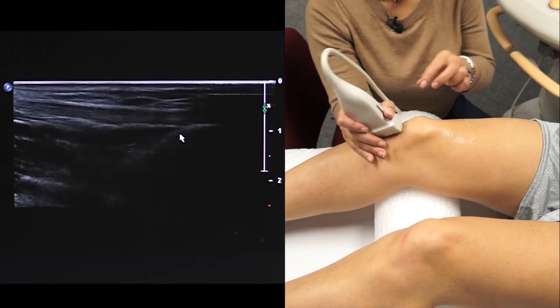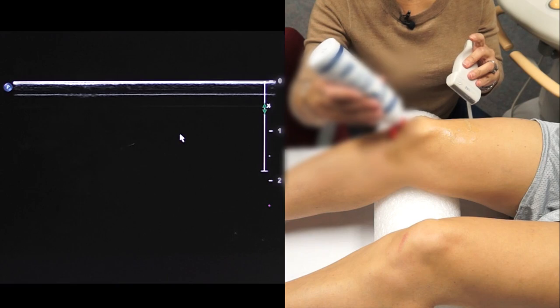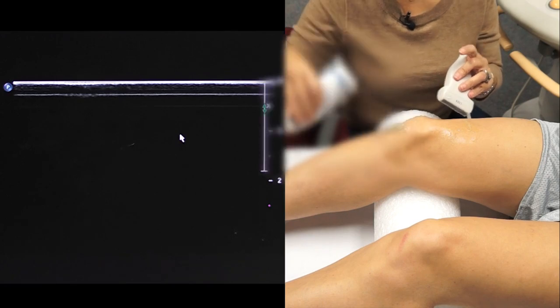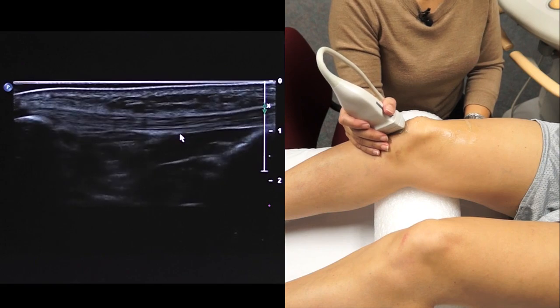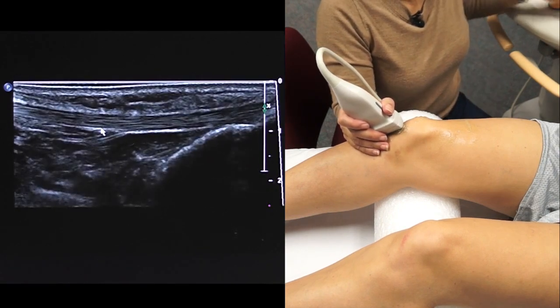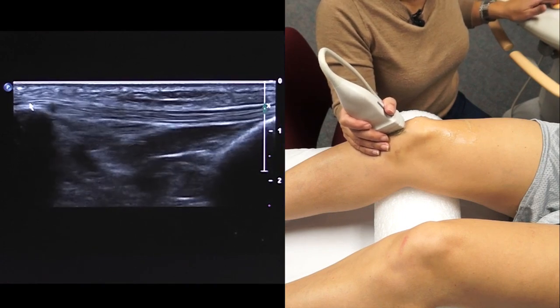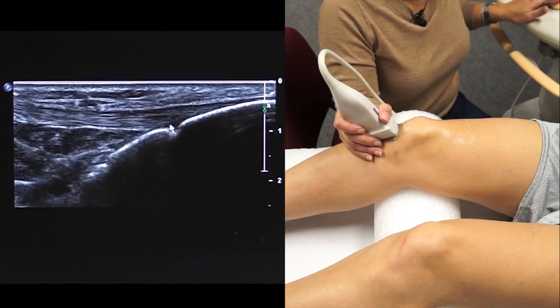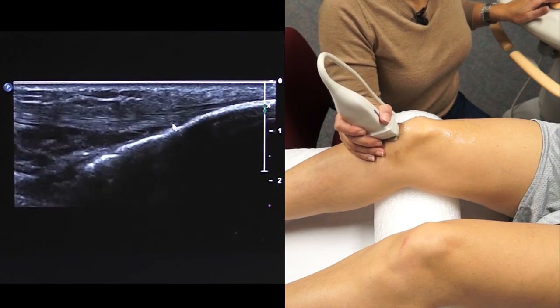Now, because this is not always a flat surface, you may want to fill that in with gel so that you maintain contact. And here you can see the patellar tendon extending from the inferior pole of the patella towards its insertion on the proximal tibia.